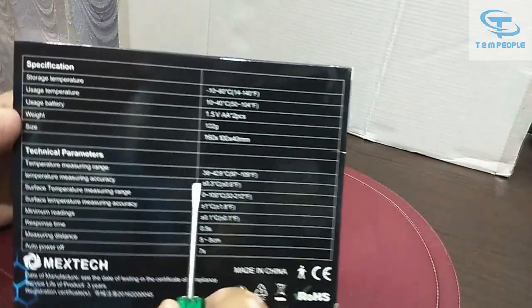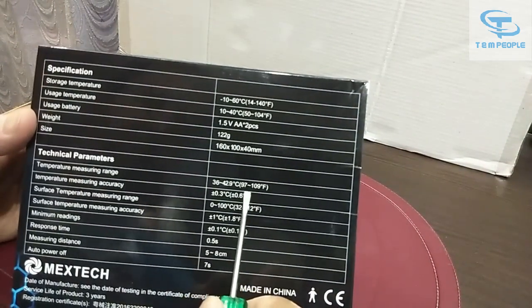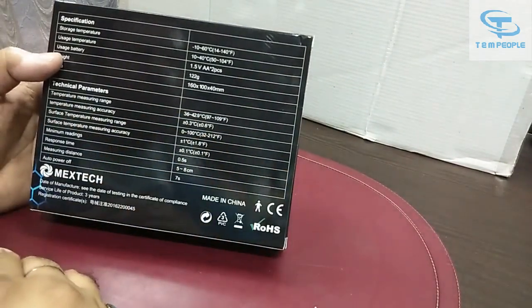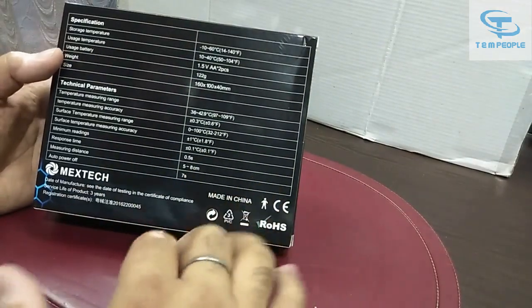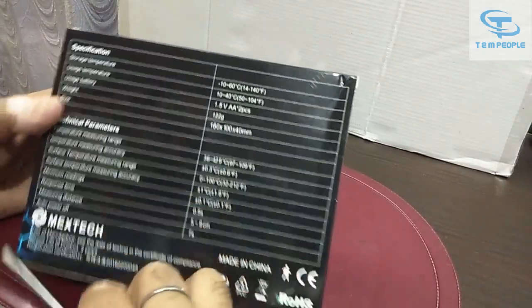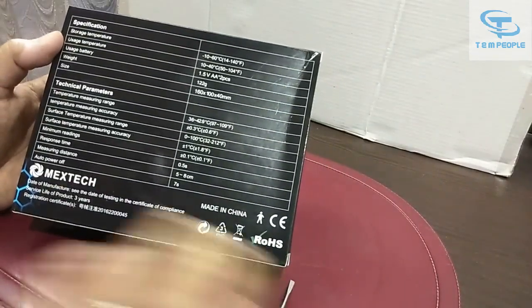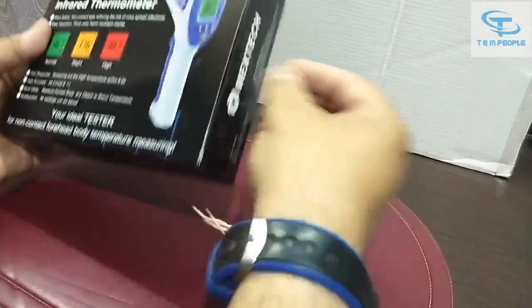Here are the specifications on the back of the instrument. The temperature range in degrees Celsius is 36 to 42.9°C, and in Fahrenheit it is 97 to 109°F. Normal body temperature in India is between 97 to 98.4°F. It uses 1.5V double-A batteries, and the response time is 0.5 seconds.